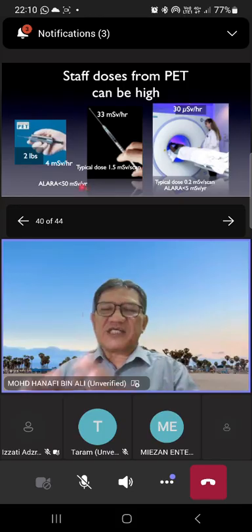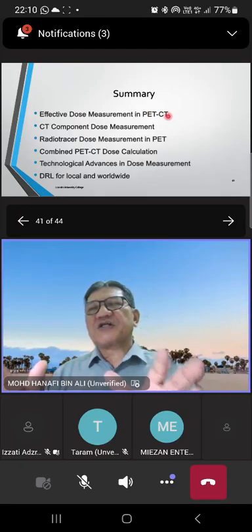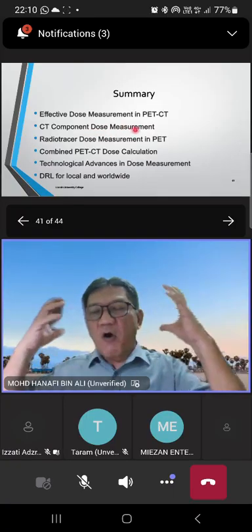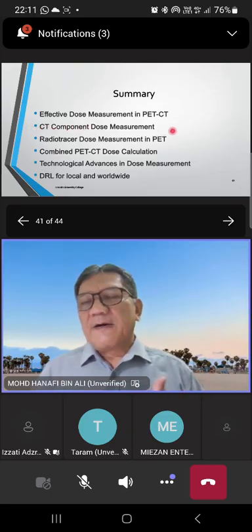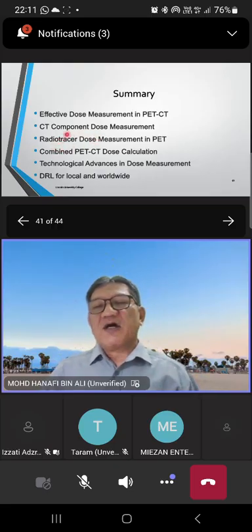But because the CT scan system is well protected and equipped with good shielding, that is a principle of protection. The radiologists use all the equipment, thyroid guard, lead gown, everything, and of course they wear a badge for radiation monitoring.